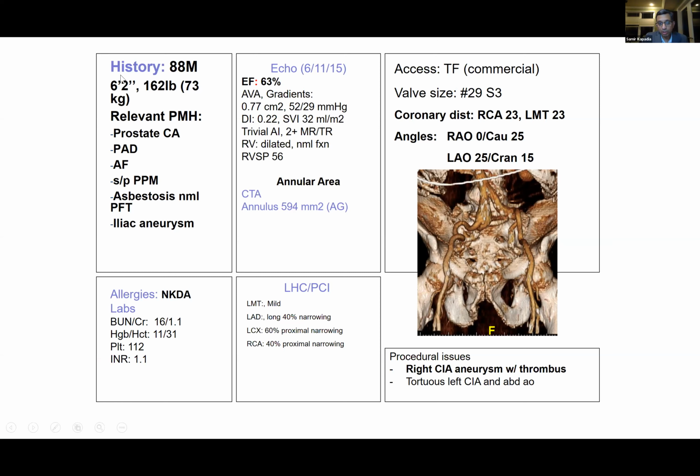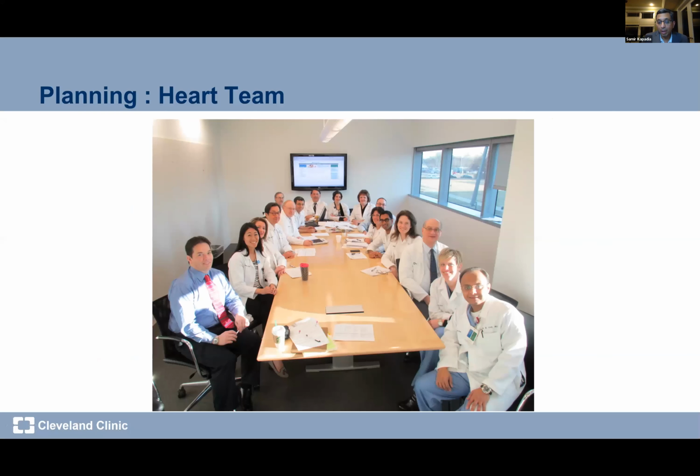It shows the history of the patient, the echo criteria, the labs, the cath, the most important things that we want to do, and if there is an issue that we need to know about. And this is the team. The very important thing that happened with TAVR was that now there is a team of people working together. So it's so much fun.